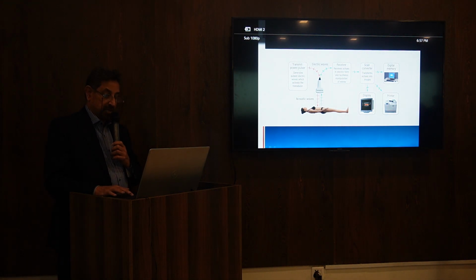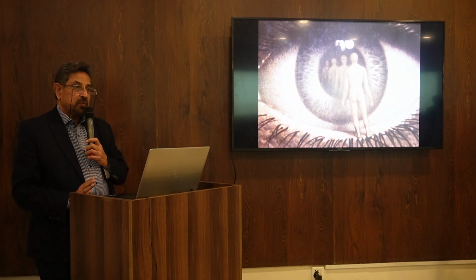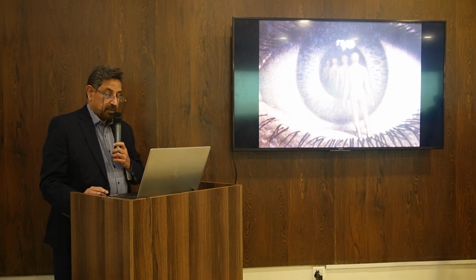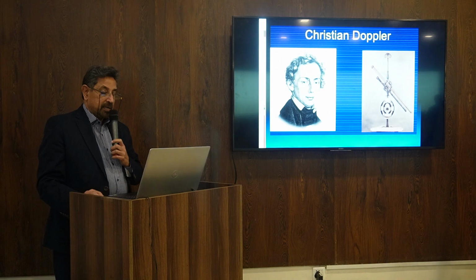How do we get a good image? We started seeing just A mode, first from obstetrics, only fetal parts, fetal head, and with the advent of newer technology, now we can do everything from head to toe. We are scanning everything, peripheral vascular, brain scan.